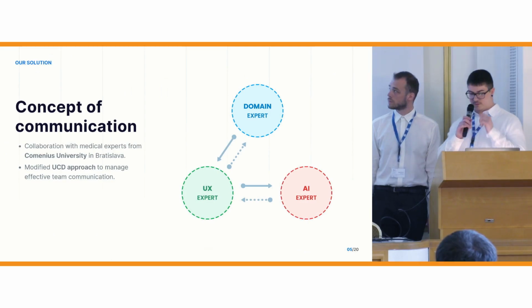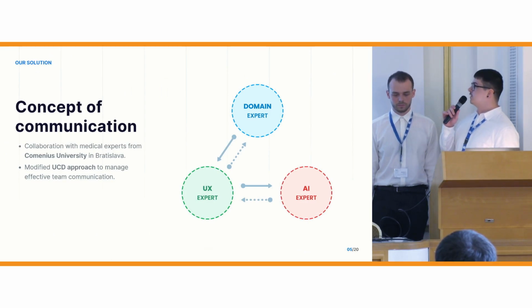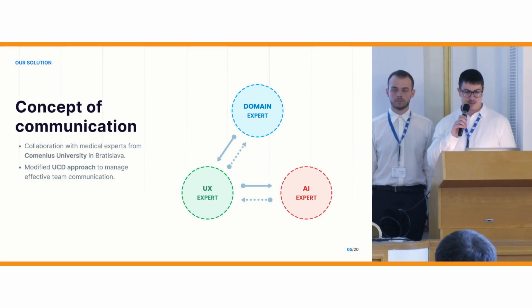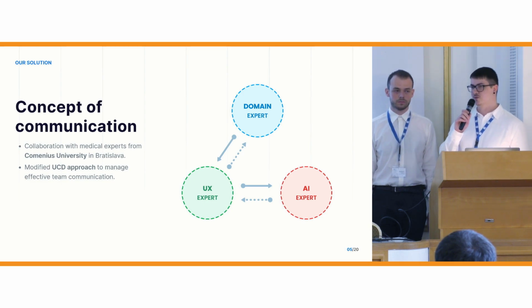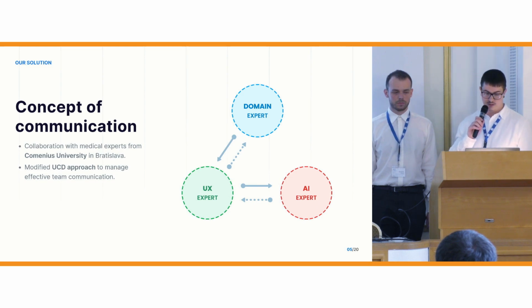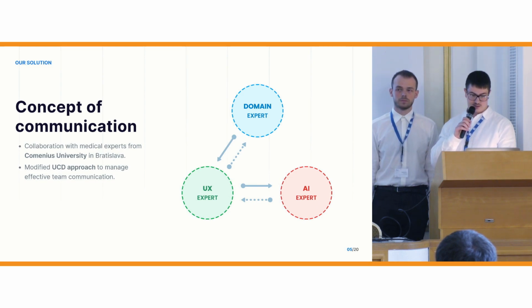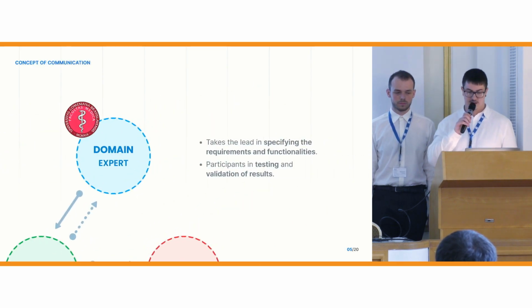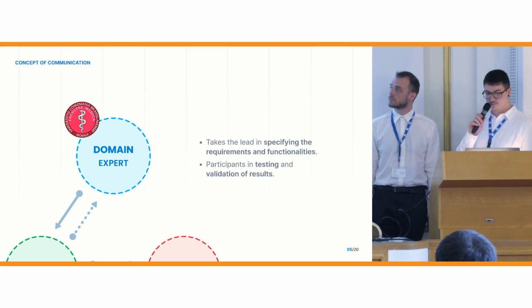To develop a user-friendly annotation tool, we closely collaborated with medical experts from Comenius University in Bratislava. Therefore, our team comprises a domain expert, a UX expert, and an AI expert. To manage effective communication within the team, we defined the following communication diagram, where the domain expert takes the lead in specifying requirements and functionalities of the tool.